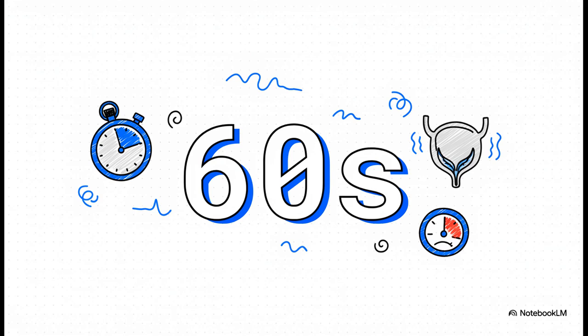And now for our second key number, 60 seconds. After you push that saline in, you have to wait a full minute. Why? This lets the bladder muscles, the detrusor muscles, just relax. If you measure too soon, you'll get a high reading from that muscle contracting. So be patient.